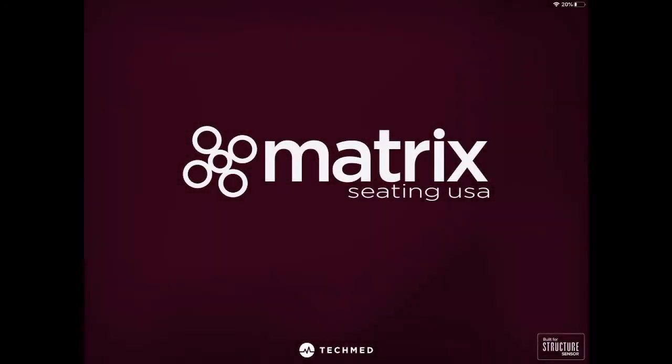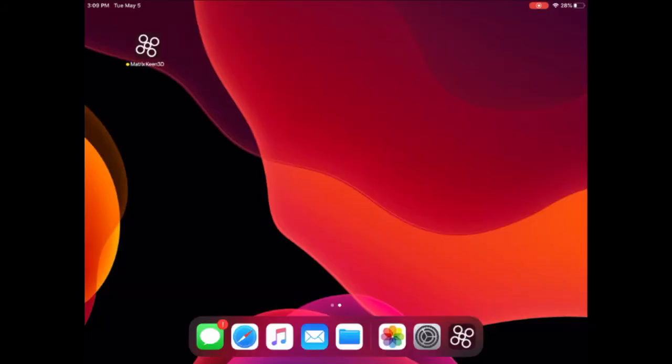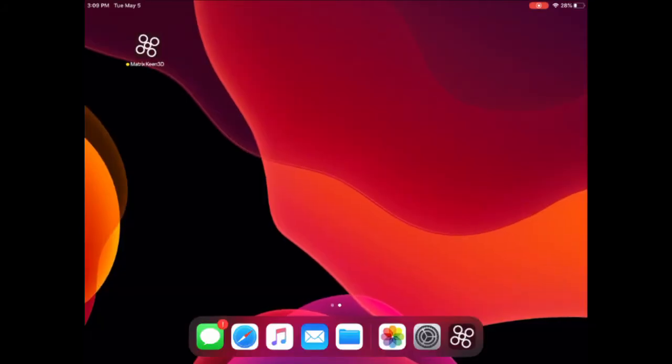Introducing Matrix Keen 3D. Paired with the new occipital Mark II sensor, Matrix Keen 3D is the most accurate and fastest wheelchair seating scanner available. When you're ready to start scanning, click the Matrix Keen 3D app on your iPad.